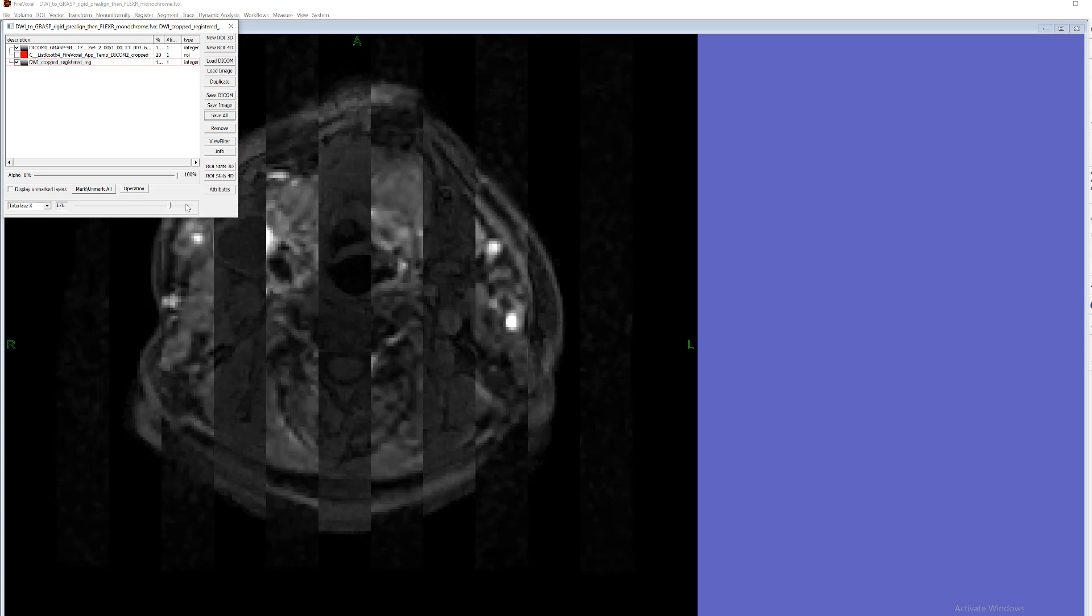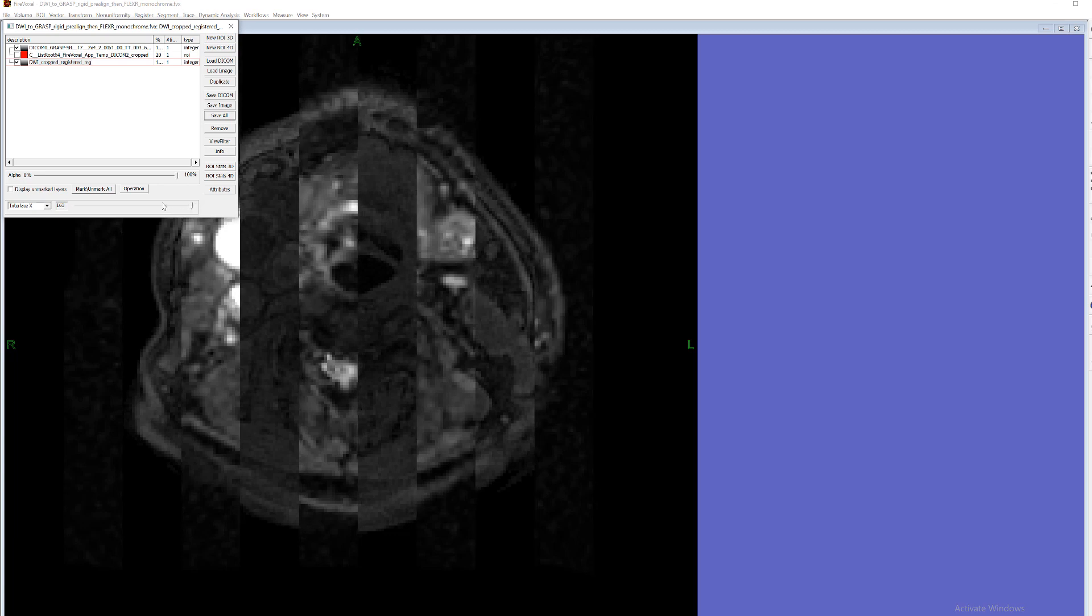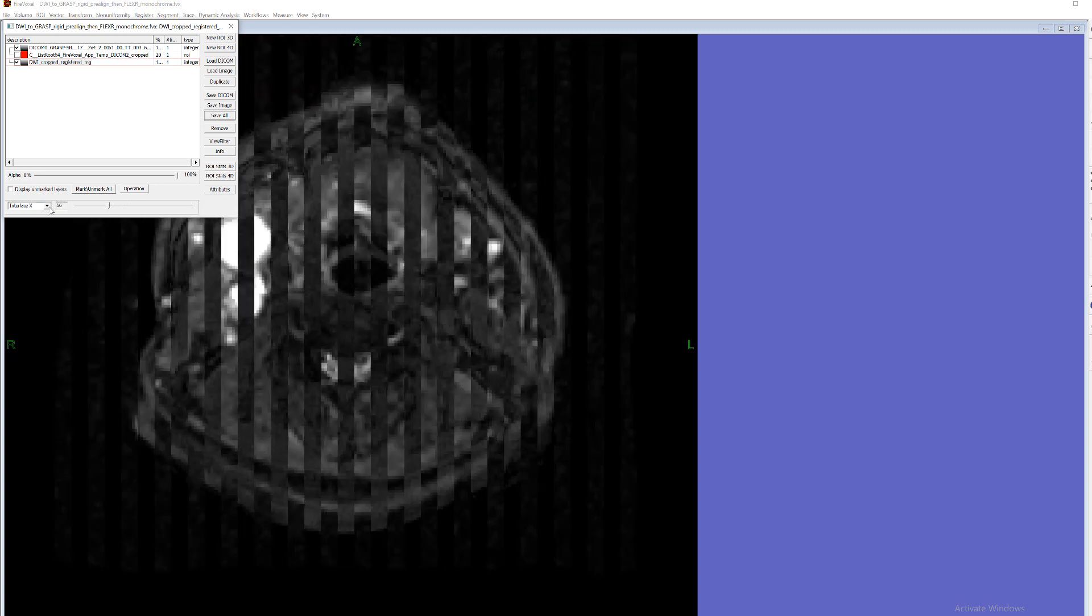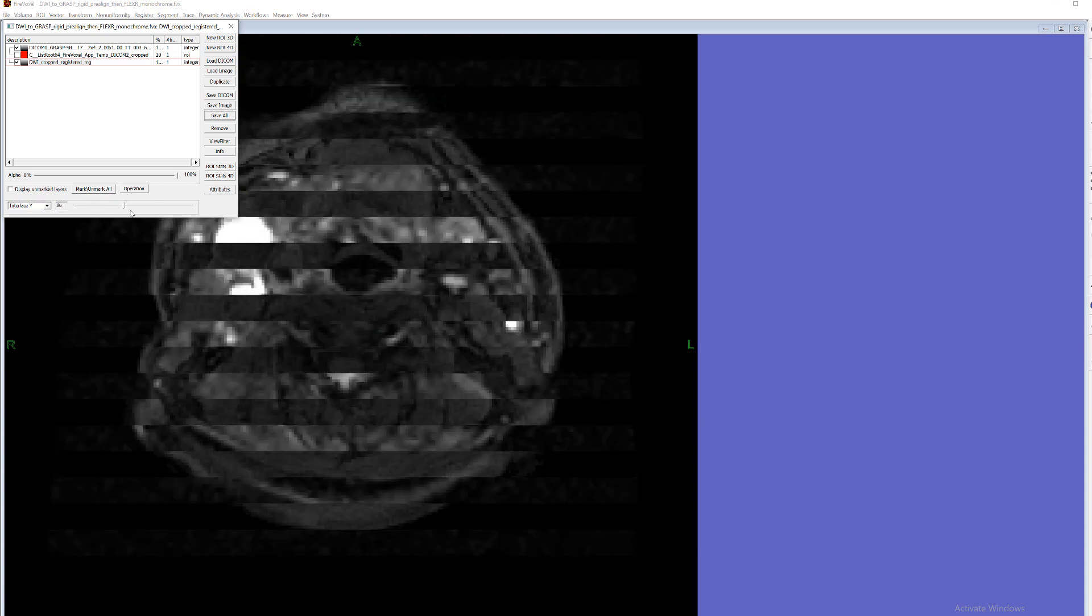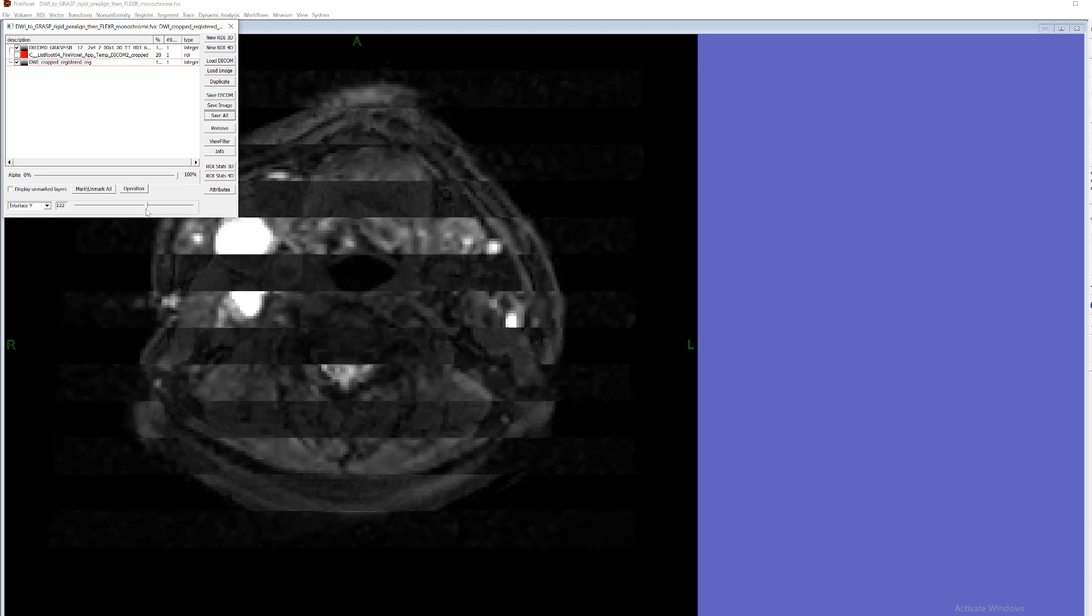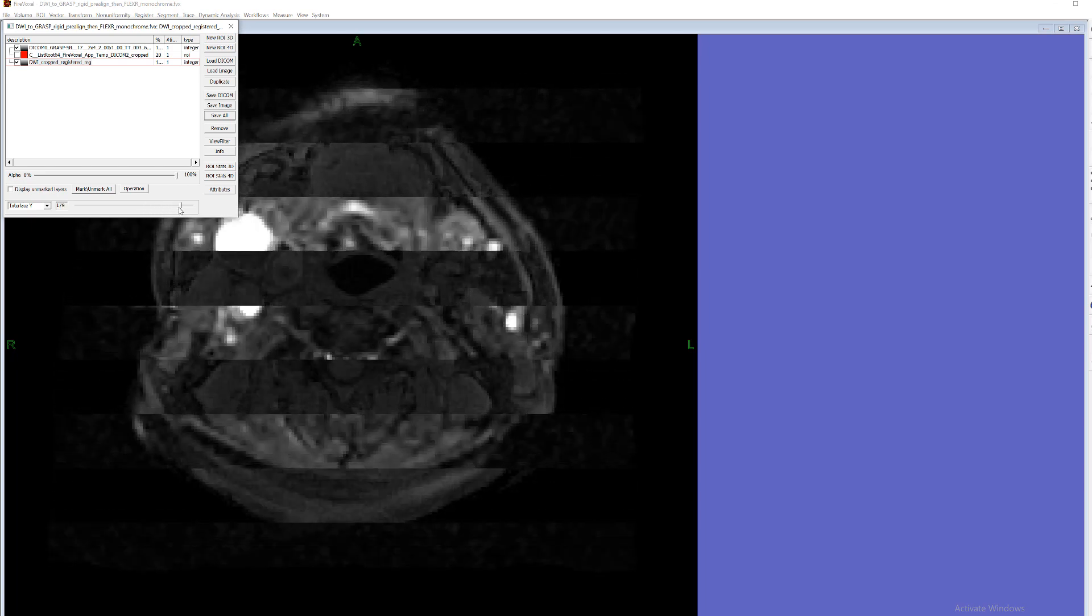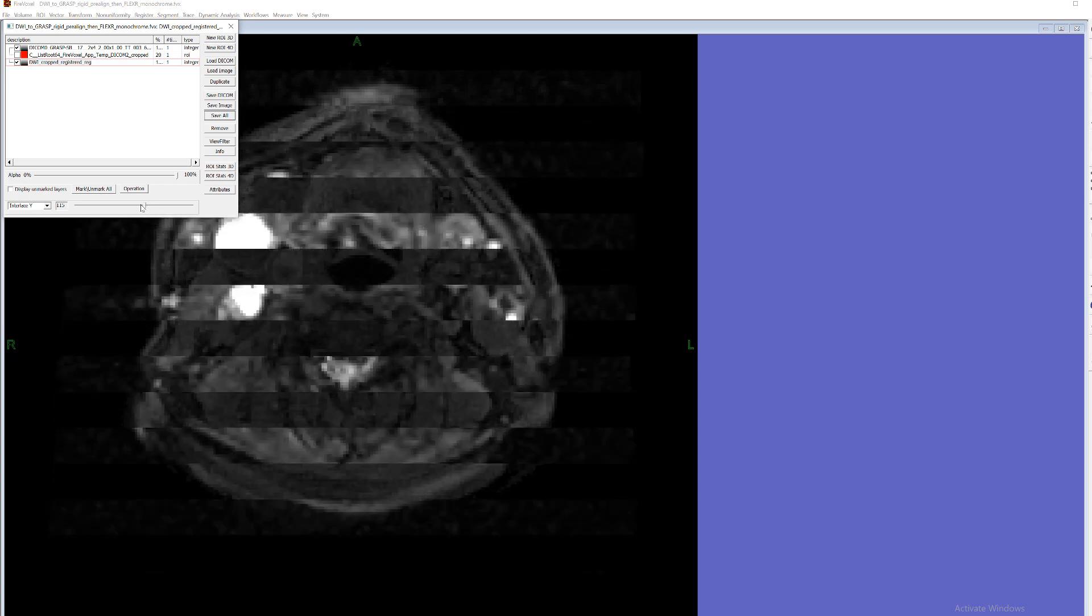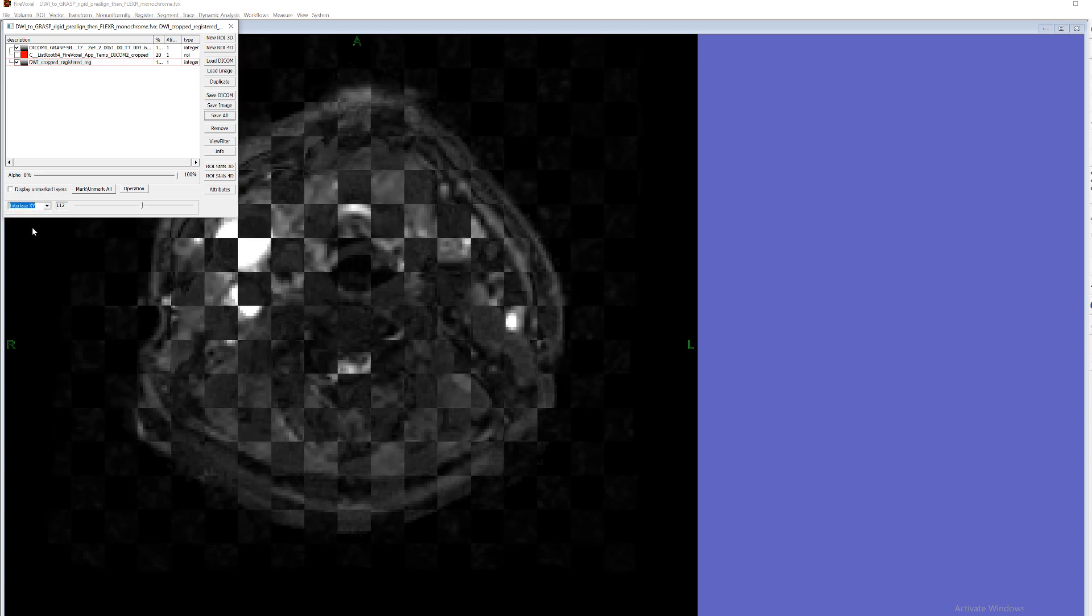Also there is Y interlacing. And there is X,Y interlacing when there is a checkerboard pattern.